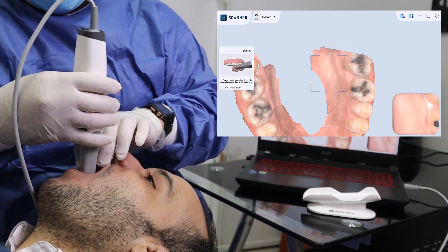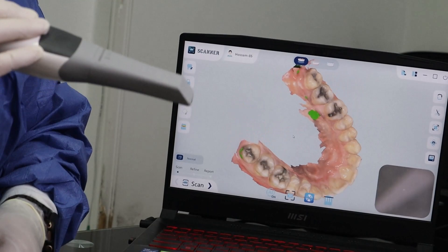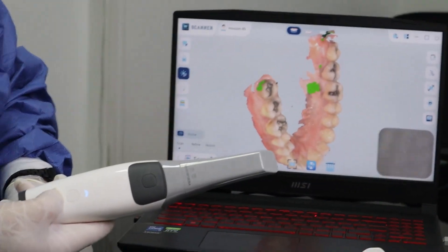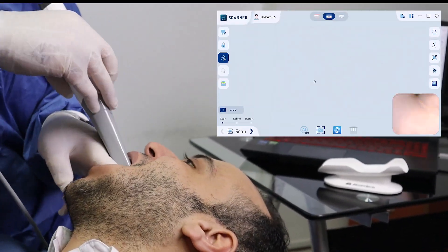Once you've finished the upper arch, click on the gray button. You can easily rotate the scan by rotating the scanner. Click on the switch mode button to start scanning the lower arch. Use the same technique for scanning.